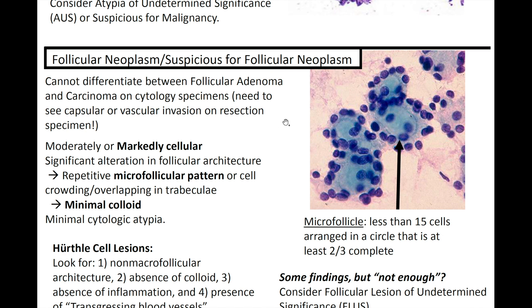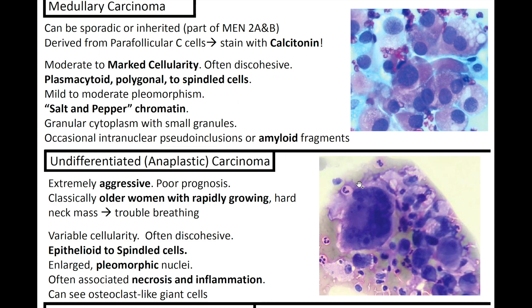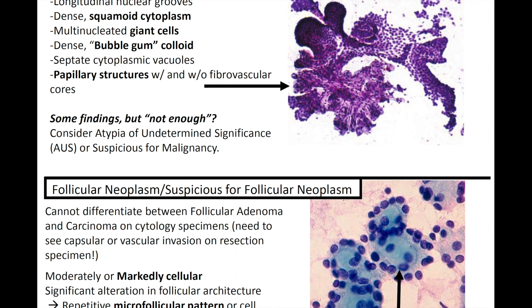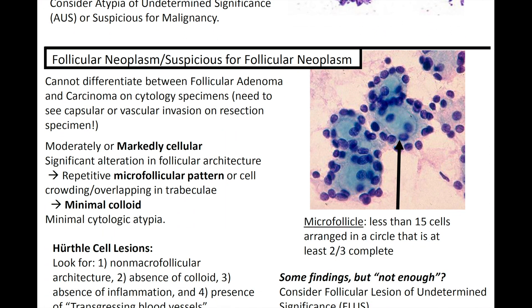Don't forget about Hürthle cell lesions. You're going to want to look out for non-macrofollicular architecture, absence of colloid, absence of inflammation, and presence of transgressing blood vessels. In this image on the right, you see microfollicles — each one has less than 15 cells arranged in a circle that is at least two-thirds complete, which is how we define a microfollicle. And if you have some findings but not quite enough, consider follicular lesion of undetermined significance, or FLUS.